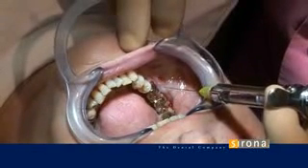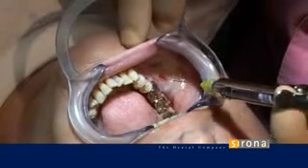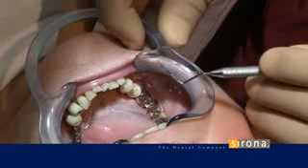First, the treatment area is anesthetized. Probe depths between 3 and 9 mm were determined. The maximum degree of loosening was 3. Some of the posterior teeth have been lost to aggressive periodontitis.